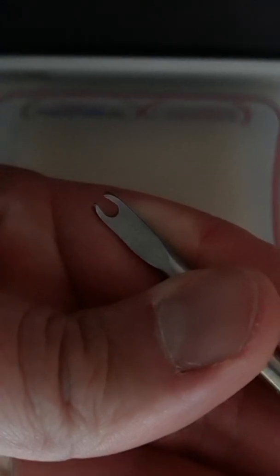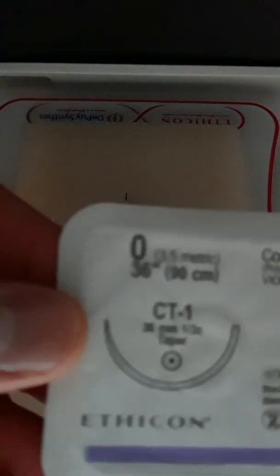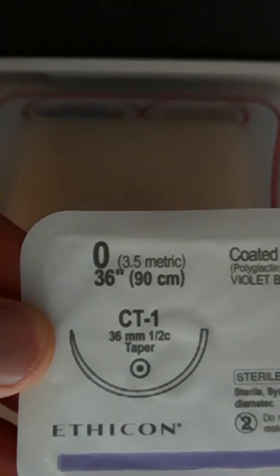We carry in our OR both open and closed knot pushers. I don't know why this is not in focus, I'm so sorry, but I think you get a better idea right now. You will need two Kelly clamps and a 90 centimeter or 36 inch length suture.